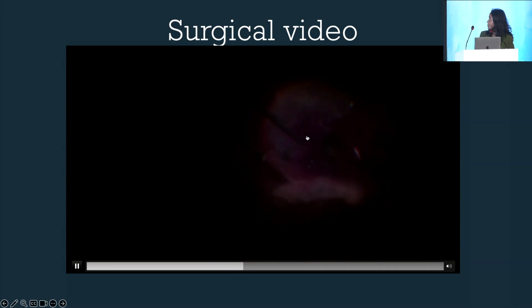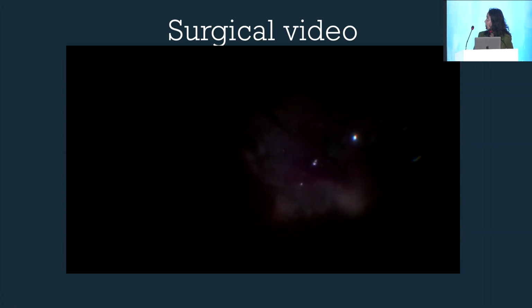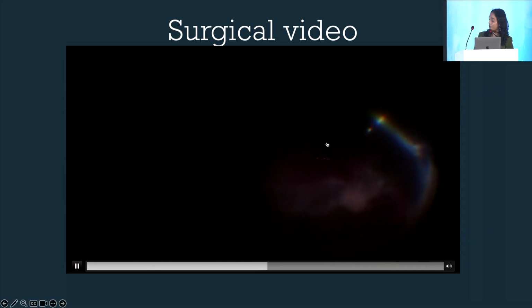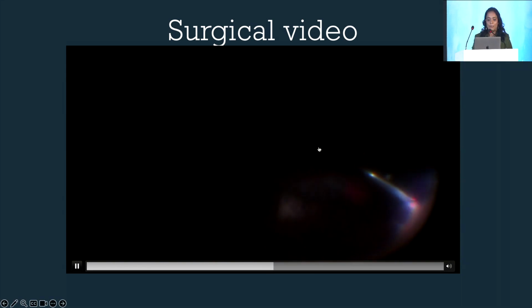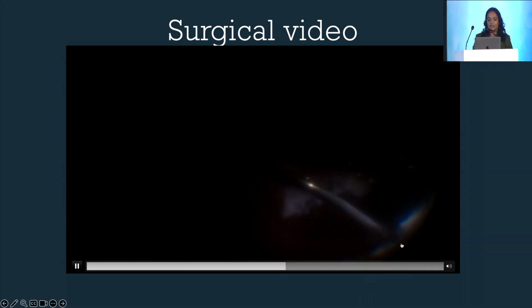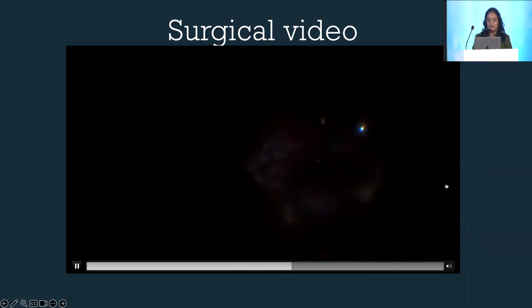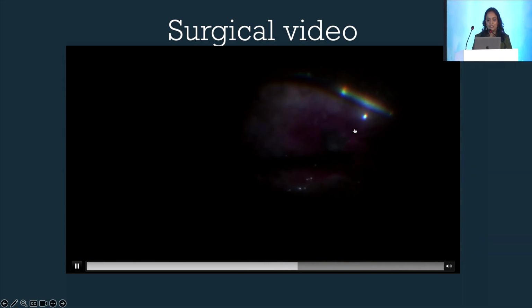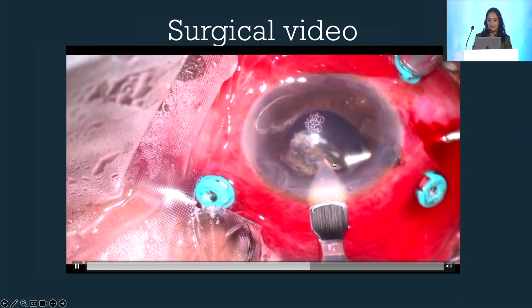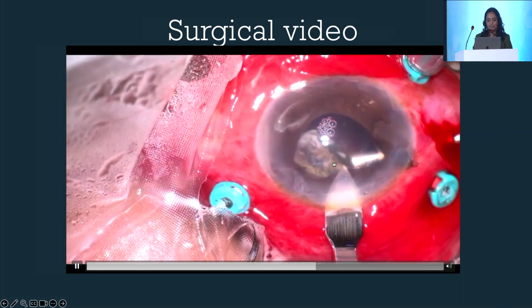And now when I put PFCL inside, the necrotic retina opens up a little, and you can see the prized foreign body right in the center. And I chose to remove all the necrotic retina at the base to reduce the load of infection. Here is the foreign body that is lying right in the center like some treasure.